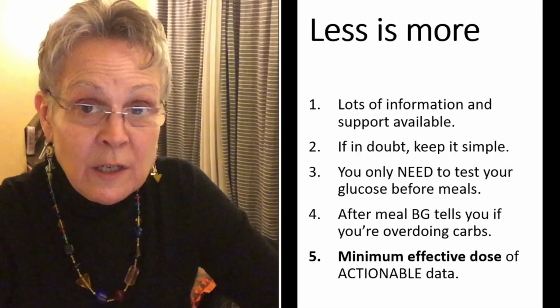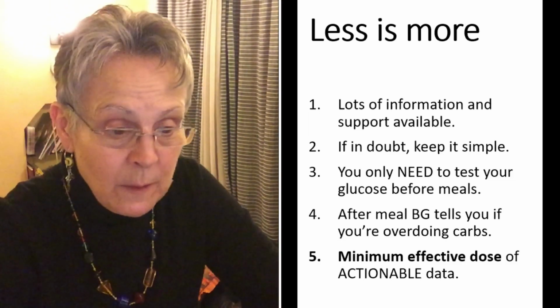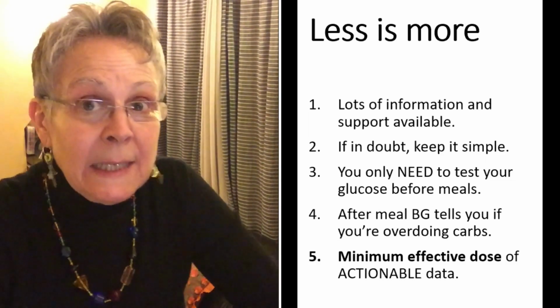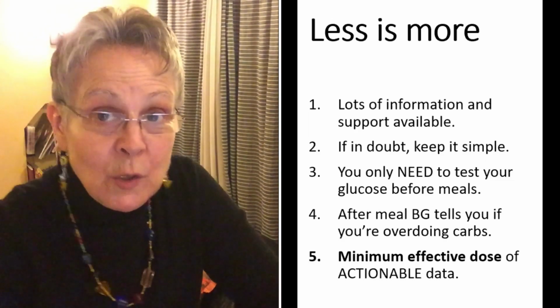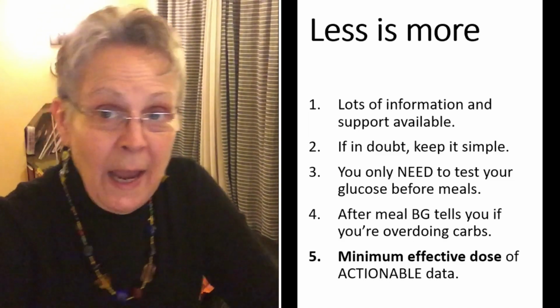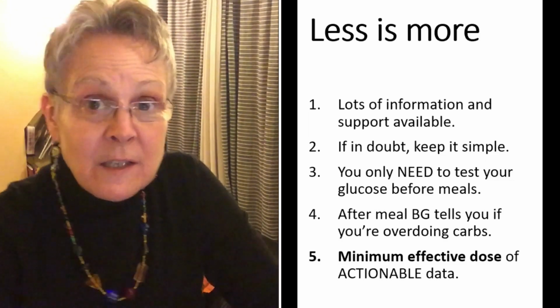Marty really is a less is more kind of guy, and he has a saying called the minimum effective dose. So I'm going to put up this image that says less is more. There's lots of information and support available in the Data-Driven Fasting community, in the free community. If in doubt, keep it simple. You only need to test your pre-meal glucose, your glucose before meals, in order to actually be able to use the information effectively to serve yourself well.